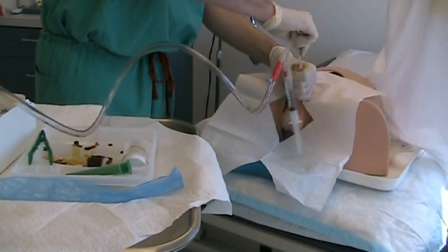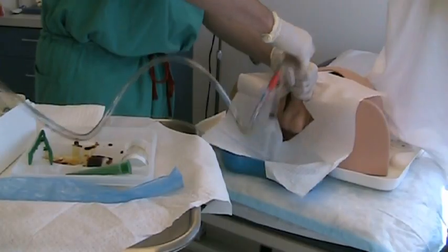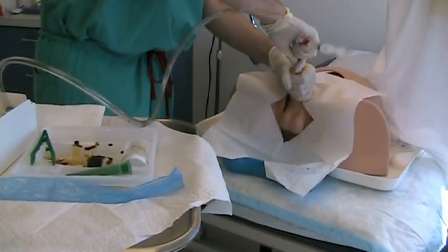If no urine is seen even after the catheter is fully inserted, gently apply suprapubic pressure.